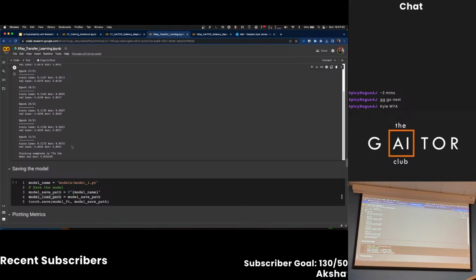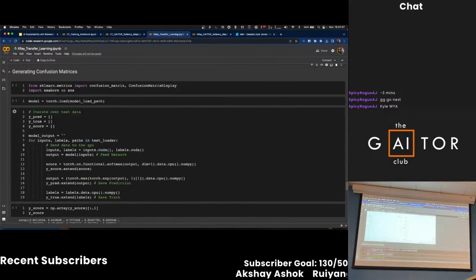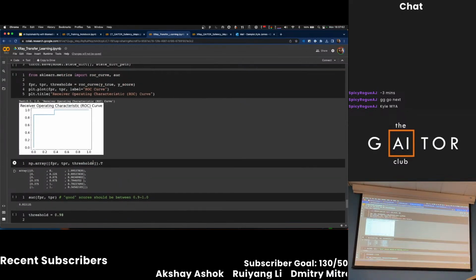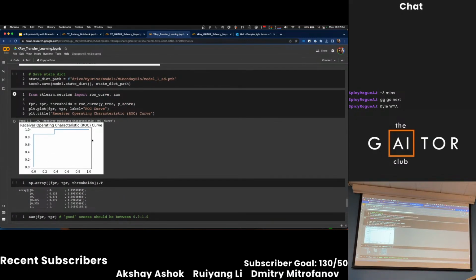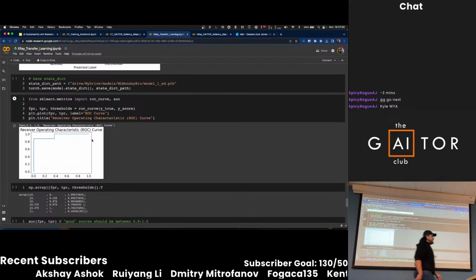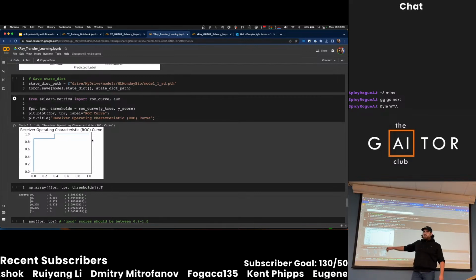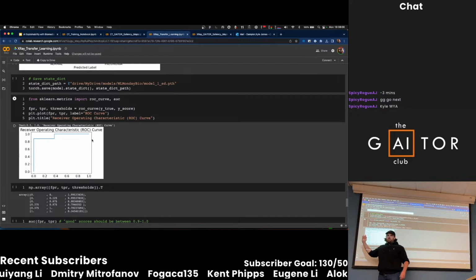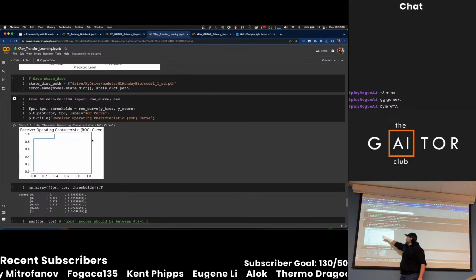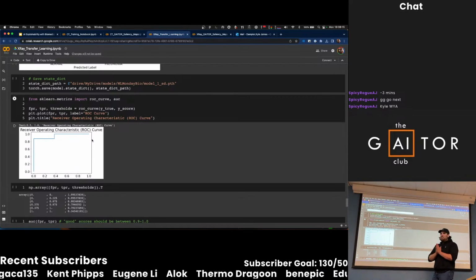Yeah, you want to show the ROC stuff you worked on? Yeah, so the way that I figured out how to make it a little more accurate was I did this thing called receiver operating characteristic. So basically, this x here would be the false positive rate, and this y here would be the true positive rate. Okay, so if we were to randomly guess, it would just be a linear equation here. So it's better than a random guess, but it's not very good.